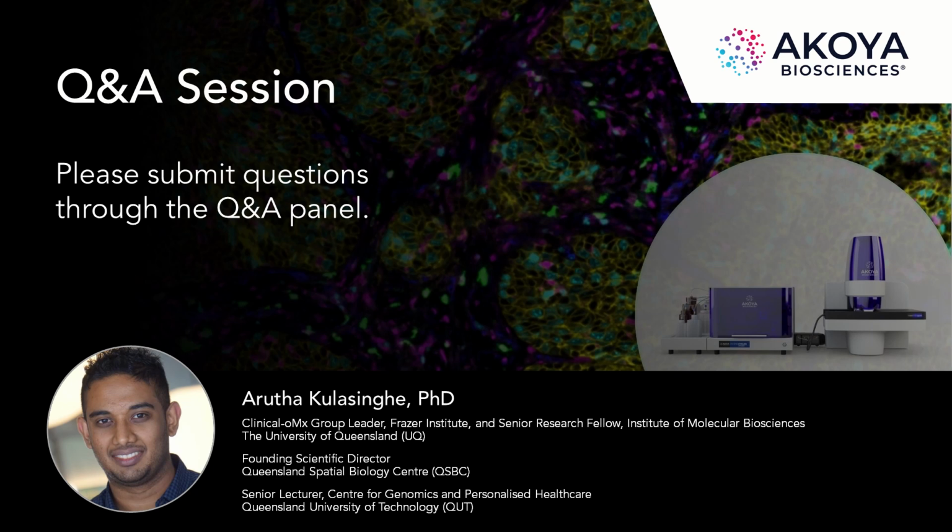We've started to do primary tissue versus lymph node metastases versus distant metastases studies. And so, we know that primary tumors are very different to metastatic tumors in that the metastatic tumors might be immune cold and so on. How it can be used to measure progression is an interesting question. You almost need to have pre-cancerous lesions all the way through to stage 4.